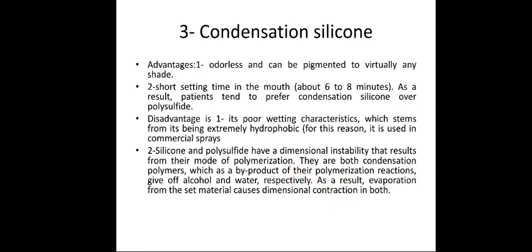And as we said, dimensional stability is very important for the impression material in order to give fine details about the sizing and the spaces, and when the sizing and the spaces of the impression and of the cast are precise, the insertion and the fitness of the restoration will be better.